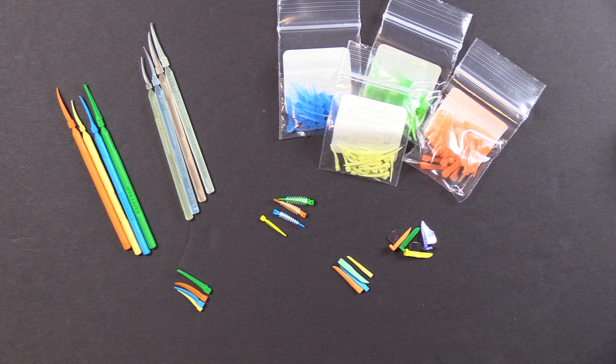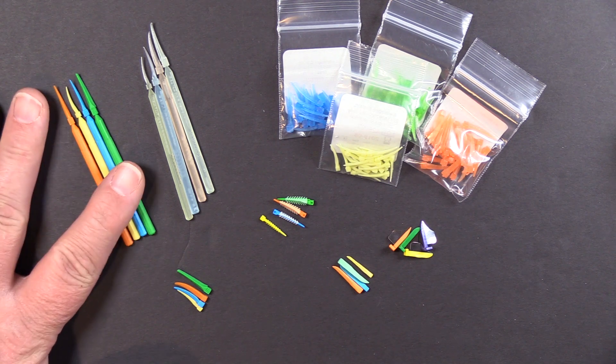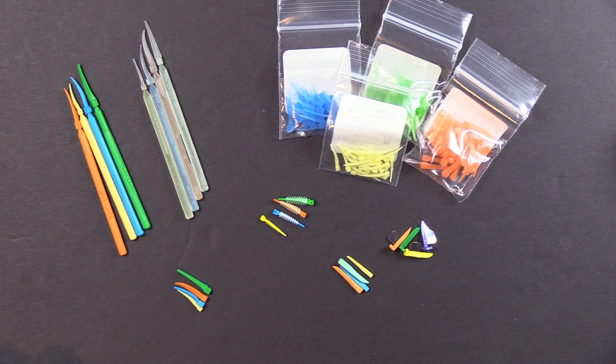We're going to look at each one of these because different questions have come up over the years about each specific one, so we'll tackle them in order. The first wedge we introduced was the Wedge Wand, here on the far left, and then a cure-through version for use with our cure-through sectional matrix system, CompositeClear.